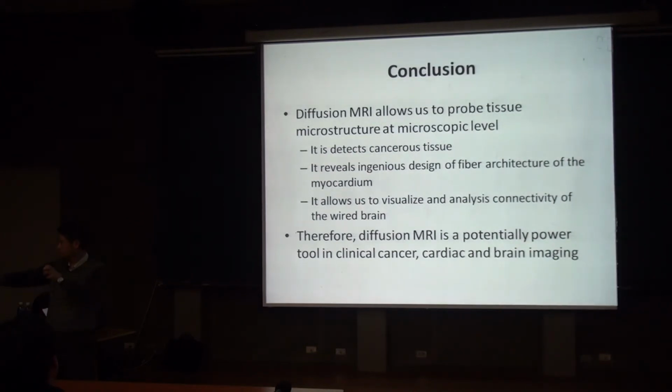Axons are the extension of the neuron, and each axon will connect to many neurons, and they do the neurotransmission, signal transmission. So an axon is very thin, like 2 microns in diameter. And in diffusion MRI, we see the fiber direction. This direction is actually the average of a bundle of the axons in that location.